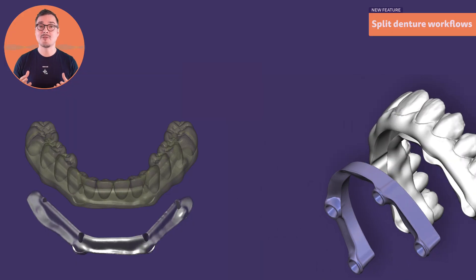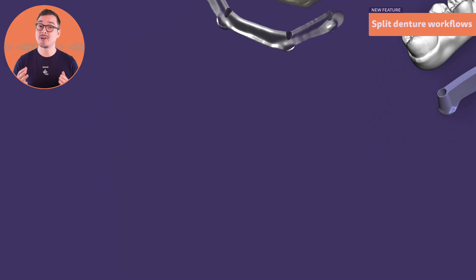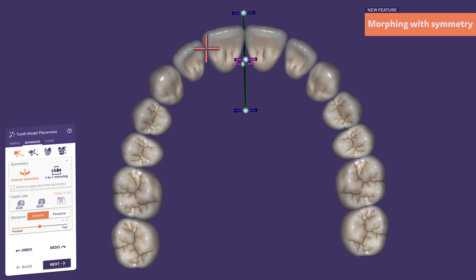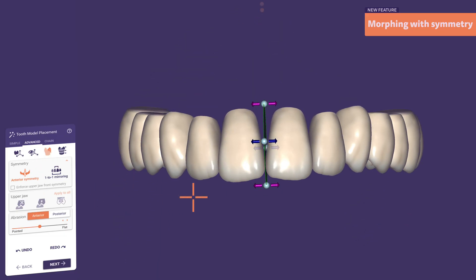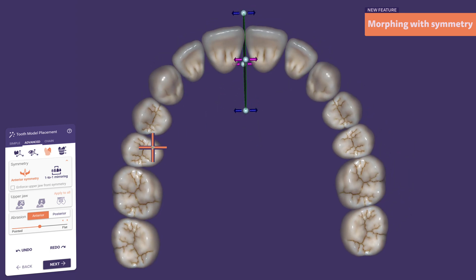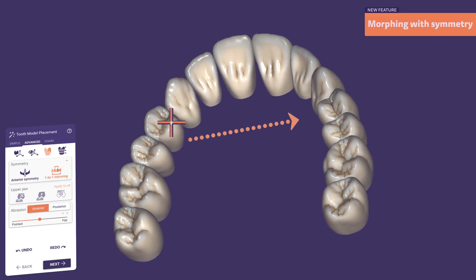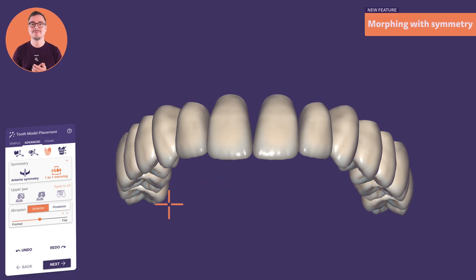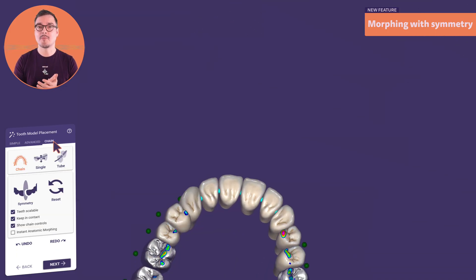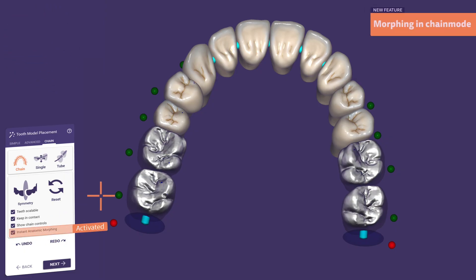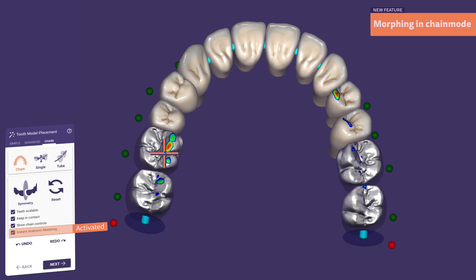Instant anatomic morphing just got even smarter with two built-in symmetry tools. Choose between anterior symmetry for classic mirroring, perfectly balanced across the midline. Together with the intuitive instant anatomic morphing tools, creating harmonious two-shapes for beautiful smiles has never been easier. The new one-to-one mirroring mode lets you add natural symmetry to asymmetric teeth by respecting their individual axis and position. Instant anatomic morphing is now also available in chain mode, giving you an even smoother design experience on a larger scale.